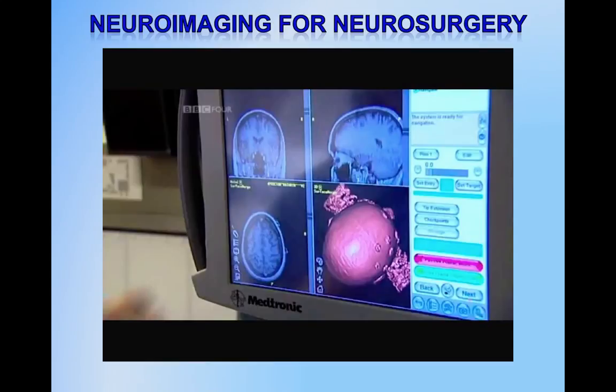Oh, yes. So what we've got here, this area here all moves the hand and arm. This area here is the foot. This area here is the leg. And then as I came up behind the lesion, we had a little bit here that was contractions in the face. Yep. And then directly behind the lesion, there was an area here that was obviously causing eye deviation. Interestingly, she reports that's exactly how her seizure starts. Right. Now that he has identified the area he can safely remove, Andrew is ready to cut out the vascular tumor.